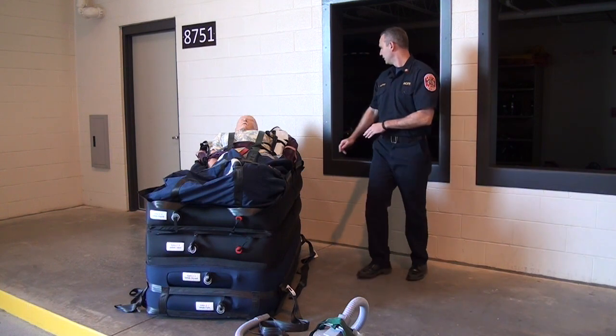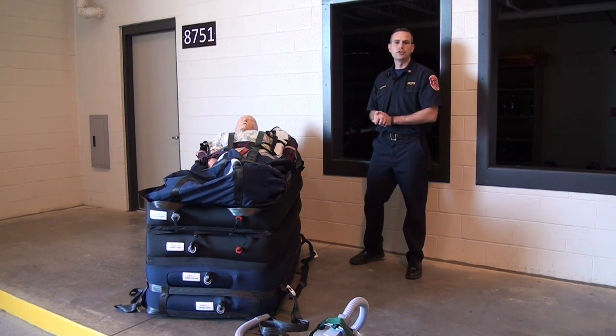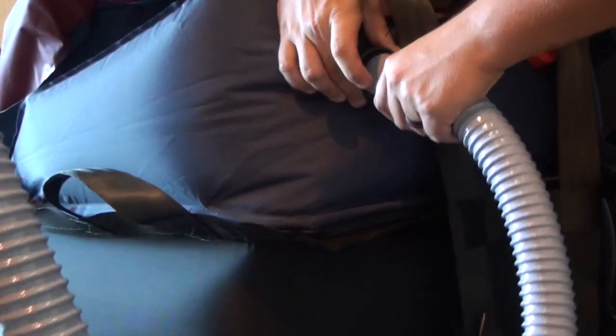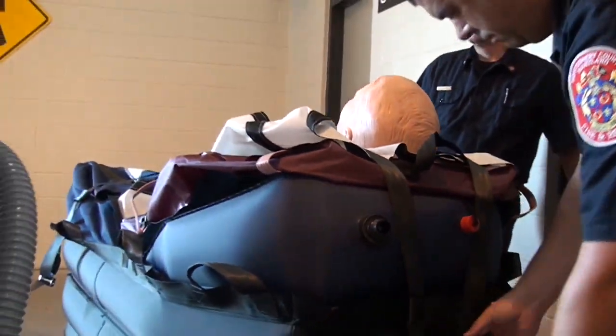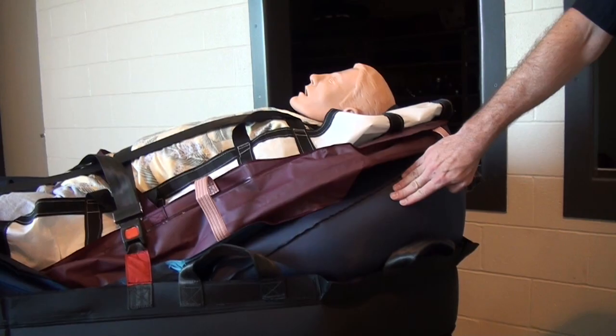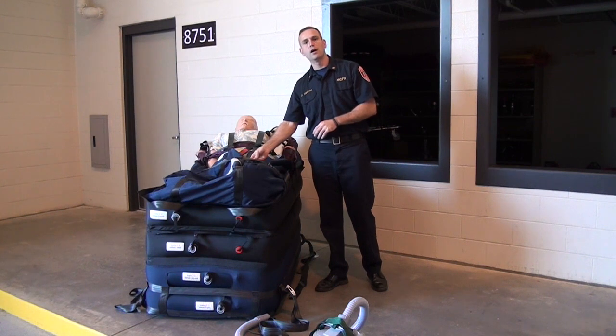We have an air pillow at the top level of the hover jack, and it's important that we inflate that air pillow on the patient as they are being raised. We need to make sure we inflate the air pillow so that we limit any respiratory distress from laying the patient flat.